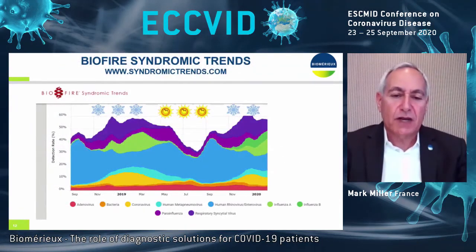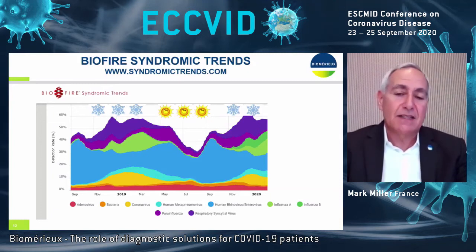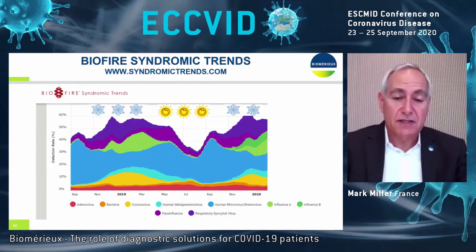To show you the point about what happens when other viruses circulate, and we don't know what's going to happen with the upcoming winter season in the Northern Hemisphere when other viruses will be circulating. If you look at this, this is data that comes from our BioFire trends analysis, epidemiologic analysis, which is free to anybody to view online at that link. And you'll see that I put the snowflakes in the winter months and the sunshine in the summer months. And even though there are less viruses circulating in the summer, there are still a lot of different respiratory viruses circulating all year round. So you pop somebody in with COVID-19 in the middle of all this with the usual symptoms, and good luck differentiating this just based on clinical signs and symptoms, whether it's COVID-19 or whether it's paraflu or RSV or human metapneumovirus, et cetera, et cetera.